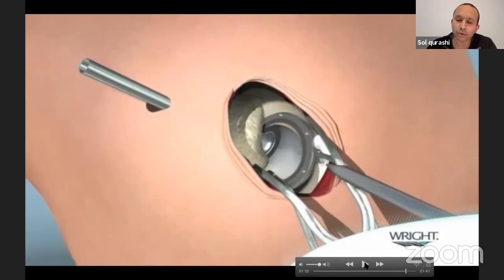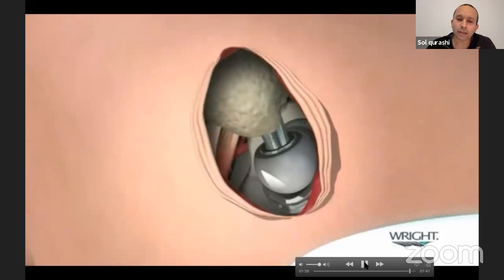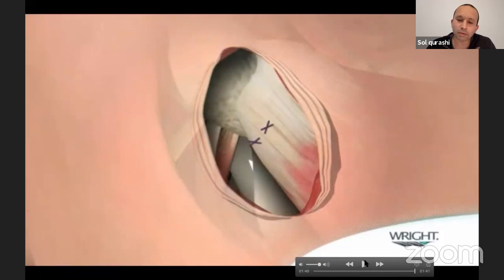And once you've done that, you put the real thing in the same way. And then you close the capsule with a running suture. In this situation, they've repaired the piriformis because they took it off. I very, very rarely take it off. If I do, I'll repair it, but otherwise we don't have to repair it. Basically just the capsule closure and then gluteus maximus fascia closure, fat, skin, and that's it.